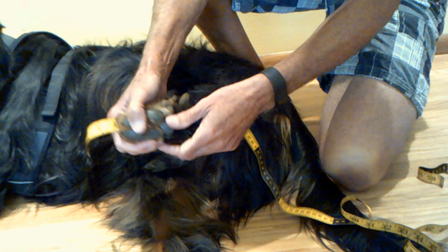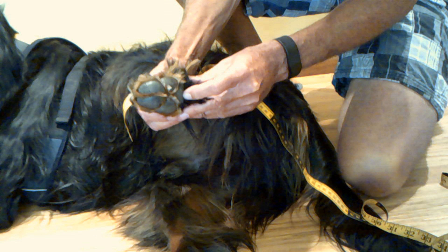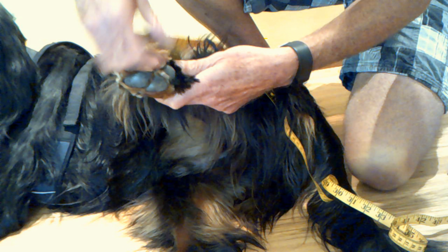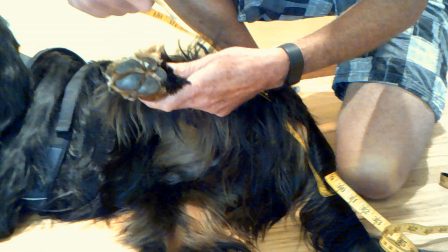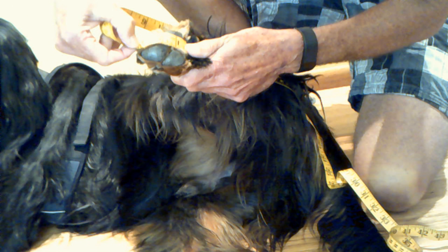The last measurement is from the point behind the back of the rearmost pad to the point between the two forward pads. For Brody that measurement is going to come up to 3 inches.